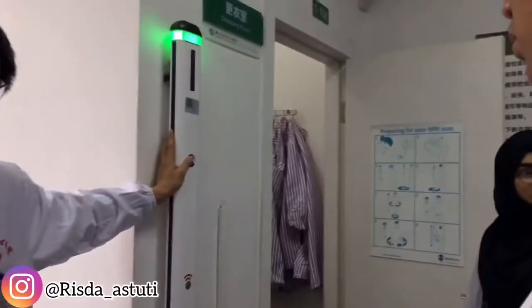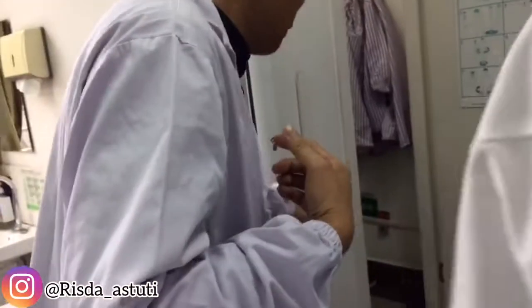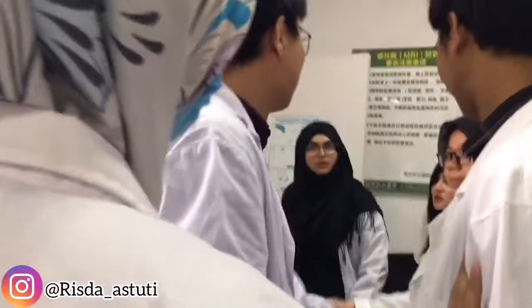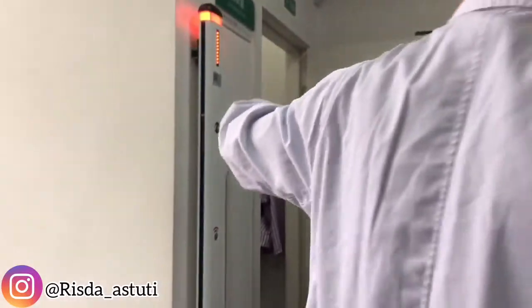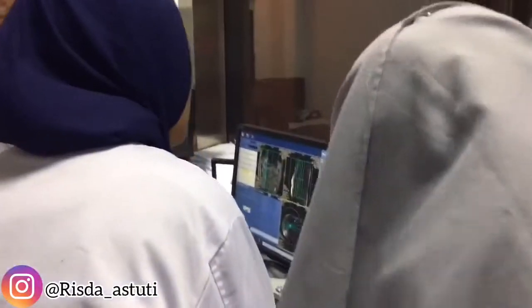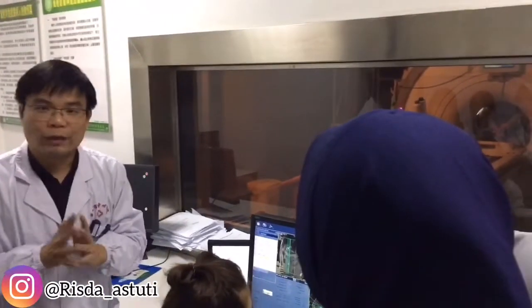This is the metal detector — to detect all metal objects. We will remove all metal from the body before entering. We will change the magnetic field and detect the metal body. This is the equipment room, or the magnetic body room. We can bring copper or other non-magnetic metals in, because they have no magnetic character.